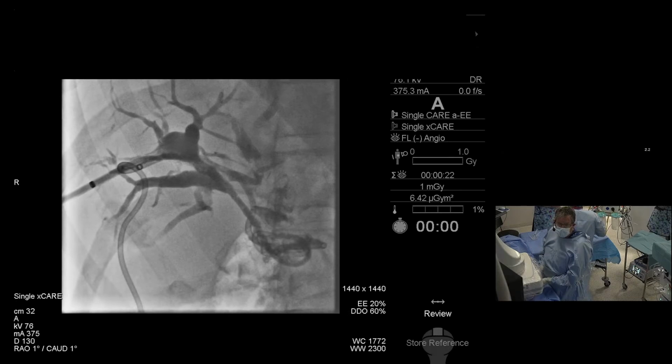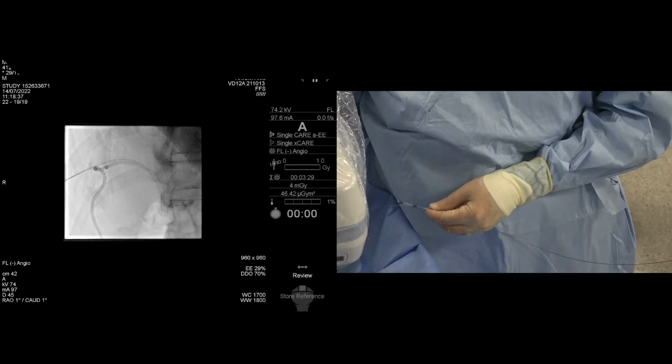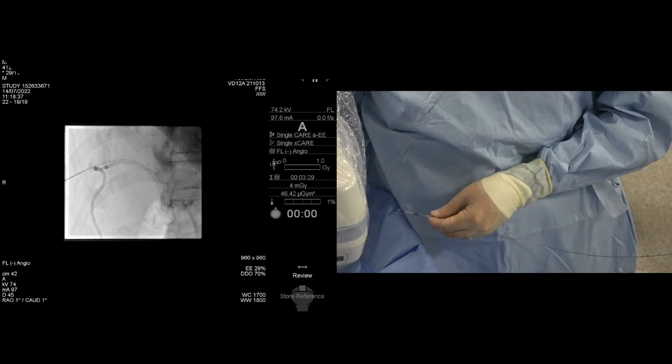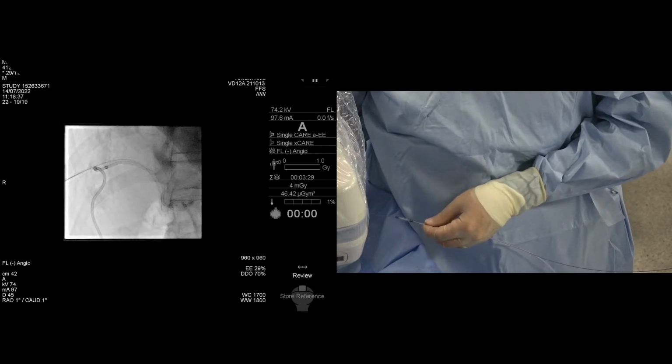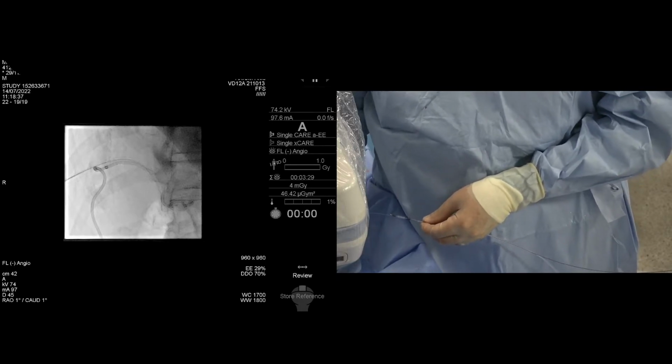The challenge here is we don't have a diagnosis. We are presuming that this is a malignant recurrence at the anastomosis. Okay, so tissue is the issue, and the more tissue you have, the more techniques to get tissue you use, the better the chance you have of making a diagnosis. I don't think we push hard enough to make a tissue diagnosis in patients with biliary strictures.